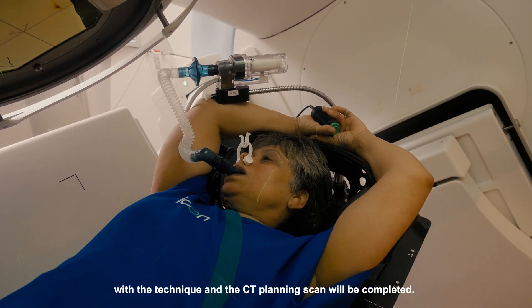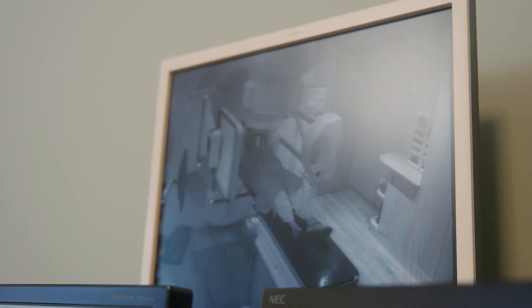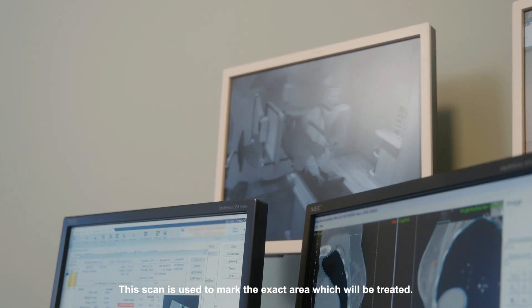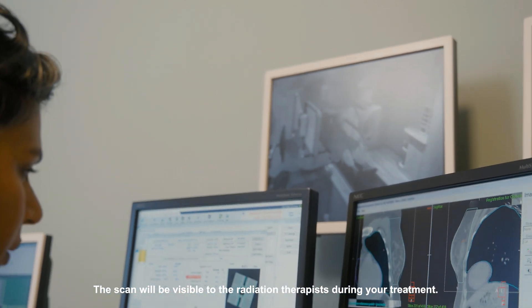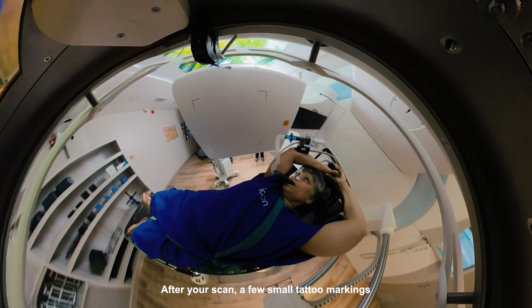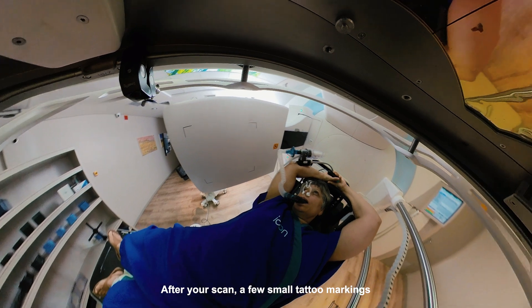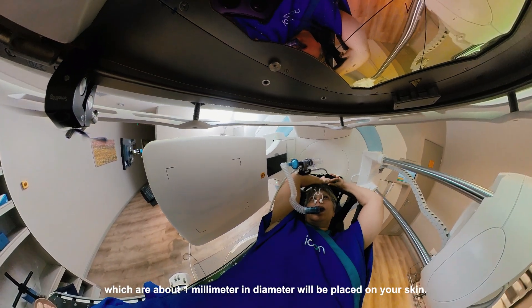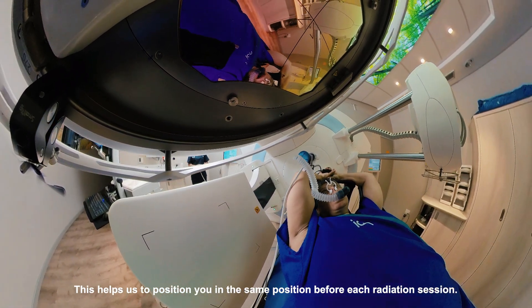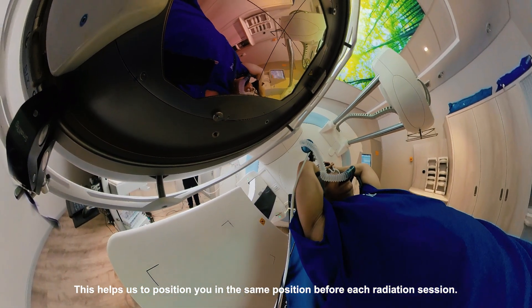With the technique complete, the CT planning scan will be performed. This scan is used to mark the exact area which will be treated and will be visible to the radiation therapists during your treatment. After your scan, a few small tattoo markings which are about 1 mm in diameter will be placed on your skin. This helps us to position you in the same position before each radiation session.